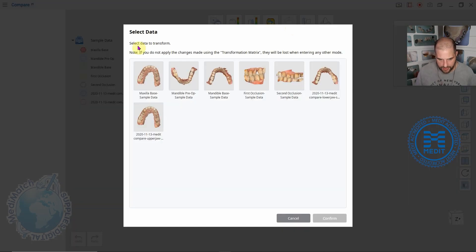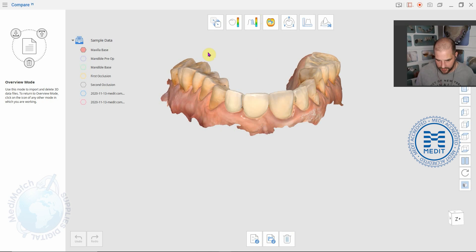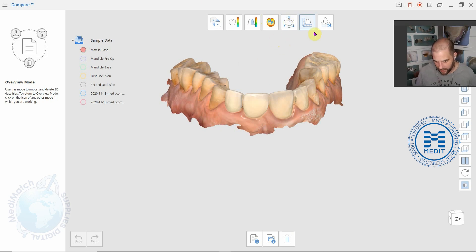The next one allows you to transform data. If you want to move it around with known coordinates you can play around with that.